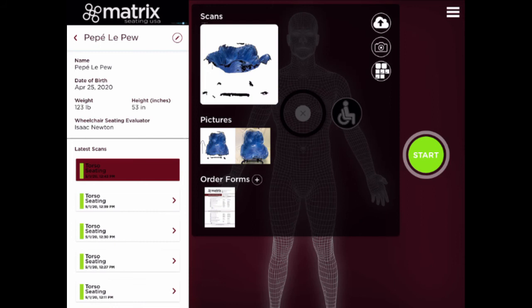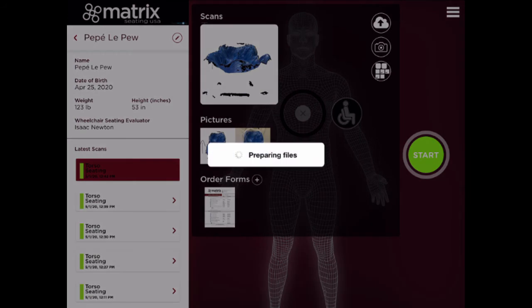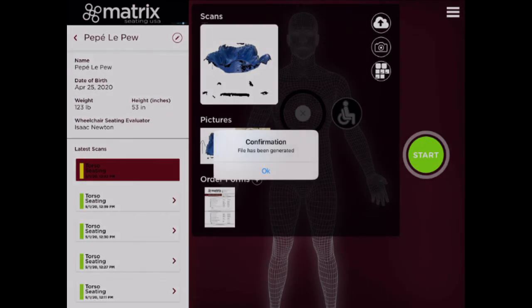Once you're ready to send everything to Matrix, simply click the Cloud button in the top right of the black box. This will automatically send the scans, pictures, and order form directly to Matrix Seating USA. Click OK and you're finished.